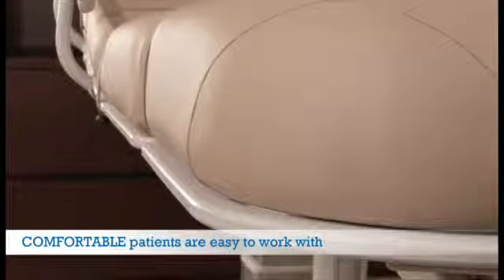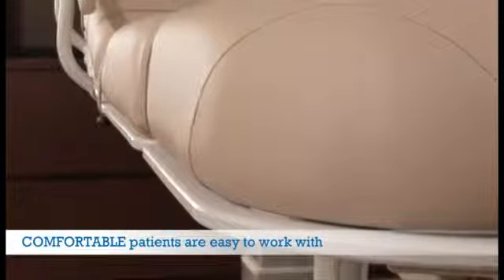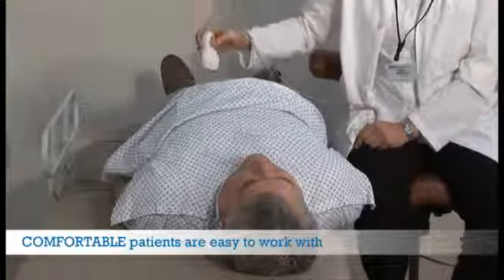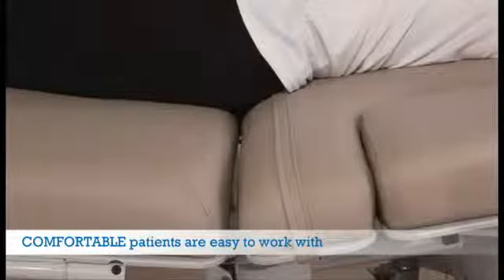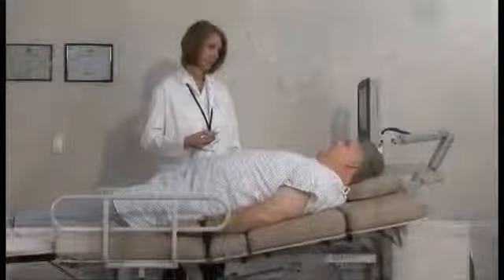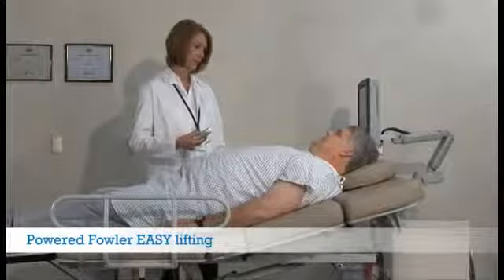Oakworks upholstery is engineered to deliver a full three inches of supportive and comfortable foam, protected from bumps with a sturdy plastic edge. The foam offers support right to the edge of the bed to allow you to move your patient closer to you. Spaces between sections of the top are minimized to improve comfort.